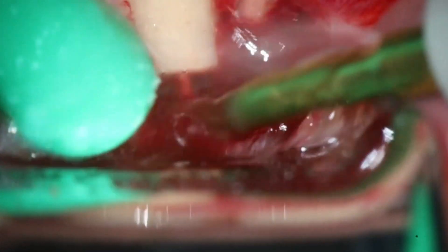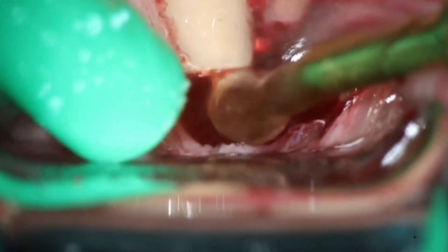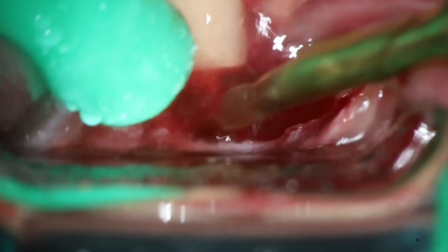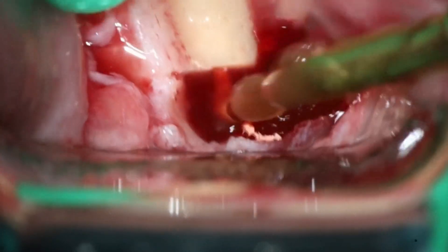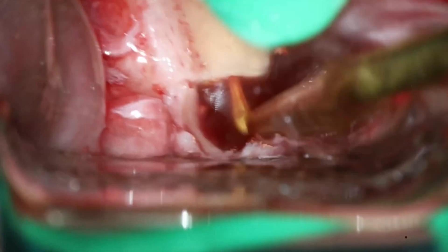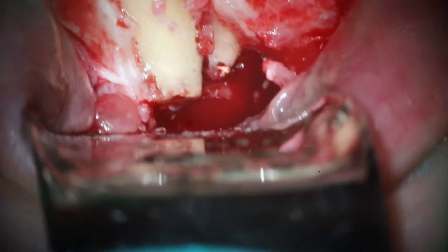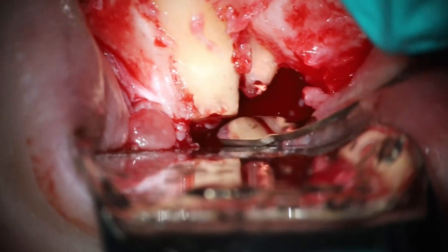This is pretty standard here. I did just order some new surgery ultrasonics from Helse that are a little bit shorter — should be seeing those coming up. I'm always changing which ultrasonics I use because there are so many different companies. This is one area where I probably buy more ultrasonic tips than I need. But that's kind of what it looks like at this point. We took an x-ray and now it's time to count.